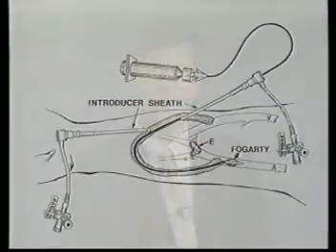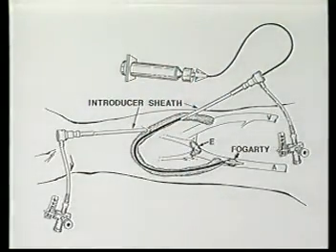The treatment of arterial embolization from dialysis graft declotting has evolved somewhat over the past several years. Asymptomatic emboli may not need to be treated, especially if that treatment involves using urokinase or surgical thrombectomy. However, there are several simple techniques for treating symptomatic and asymptomatic emboli with little or no additional risk or cost to the patient. The first of these is the backbleeding technique.